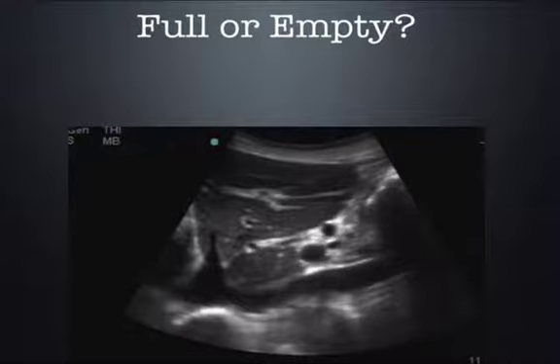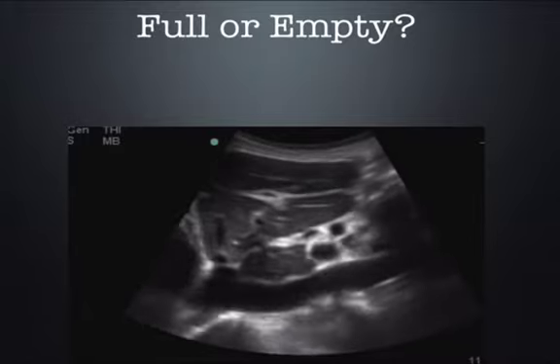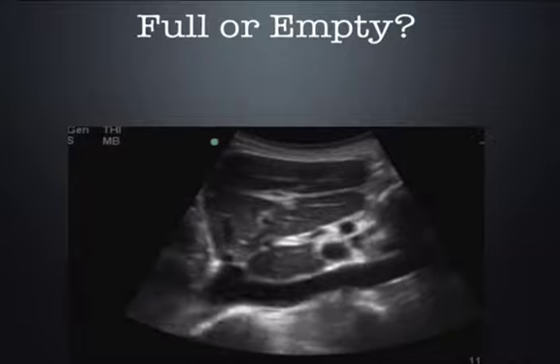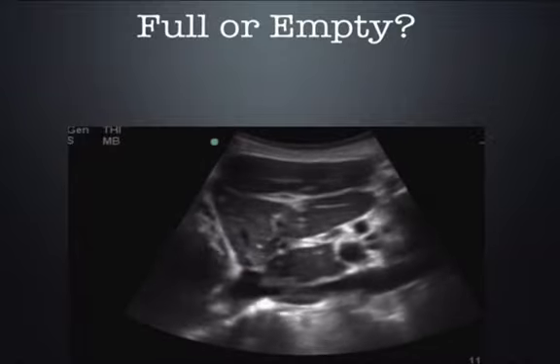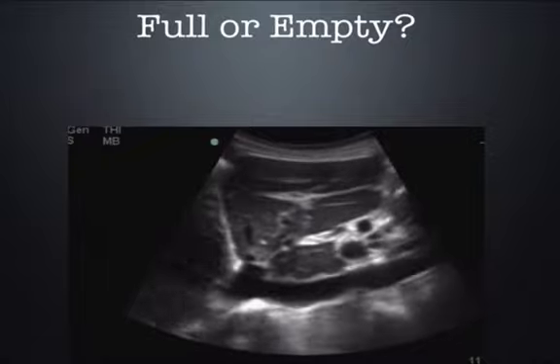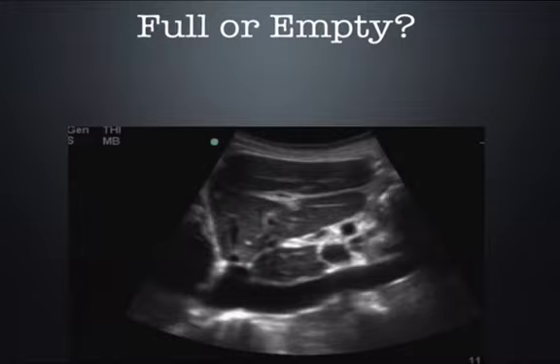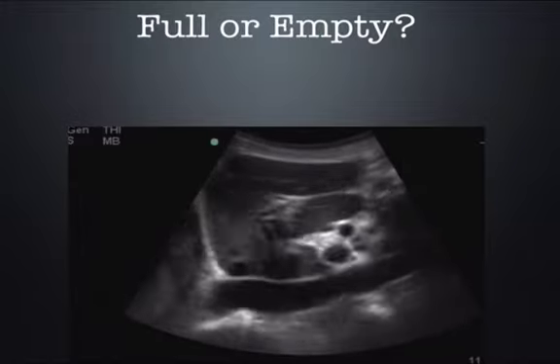So what do we do with the in-betweeners? The subjects whose IVC is not fully collapsible, the subjects whose IVC is not plethoric and resistant to collapse with respiration. What do we do with this subject right here? In this case, just looking at it, doing kind of a qualitative analysis, which is all you really need to do, I'm not an advocate of measuring the IVC and getting exact numbers. Just look at it and say it's approximately a 50% collapse with inspiration.